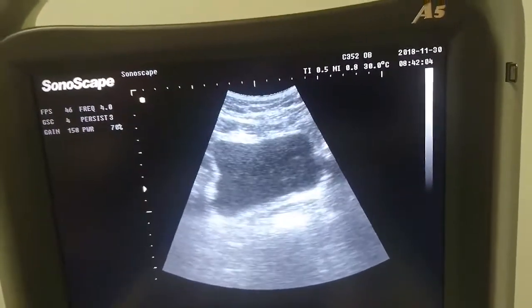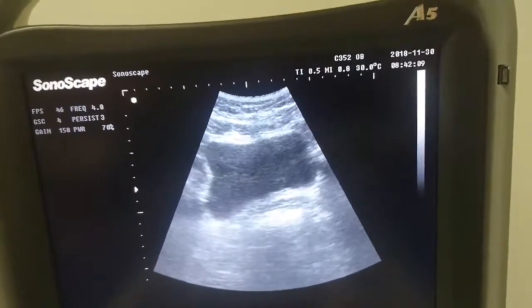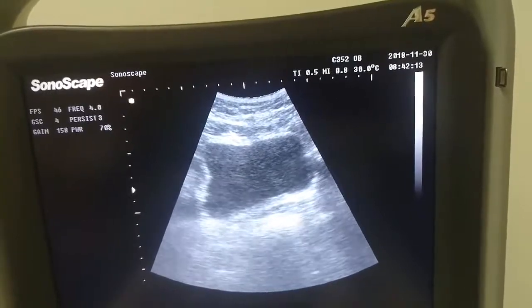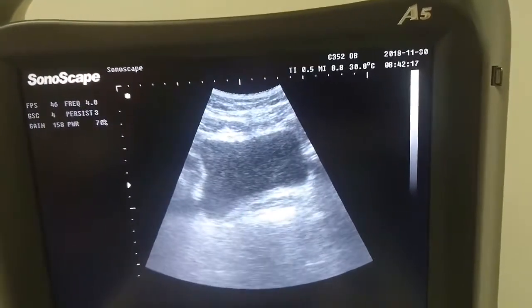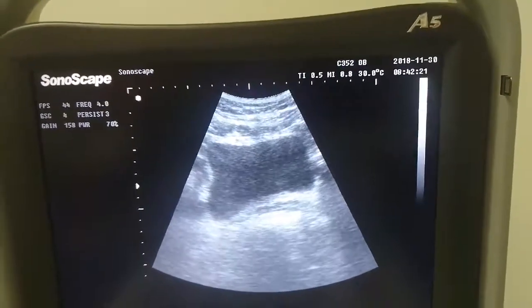Sharon, focus on your pubic bones, squeeze and hold your wee muscles forward and then relax. What we can see in this position is a lift. Can you do that again for me, Sharon? On one side it goes up the screen and on the other side it drops.